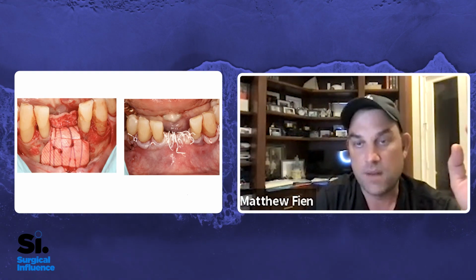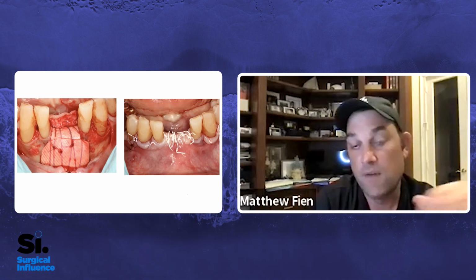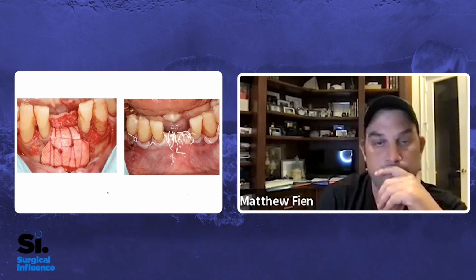We're using mostly resorbable sutures for these mostly horizontal defects nowadays, but the truth is PTFE, you can't go wrong. 3.0 PTFE, very tissue friendly. It's going to be there in 2 weeks, so it's doing what it's supposed to do. It looks like they have pretty good dual layer closure here. For me, probably more sutures than I think is needed, but it looks pretty good at this point, I think.